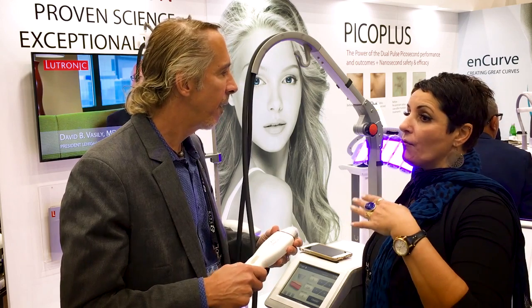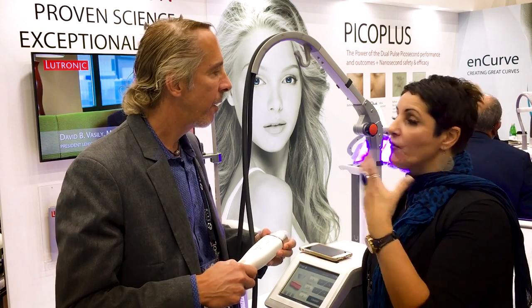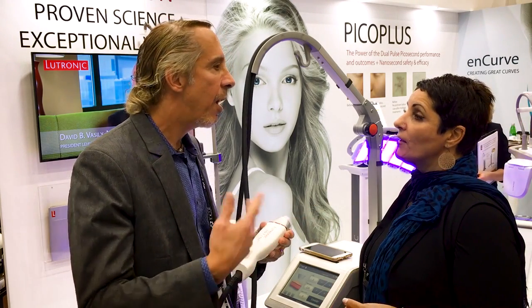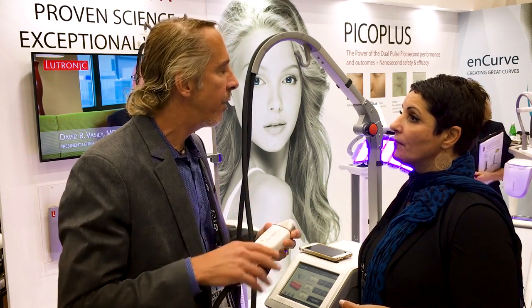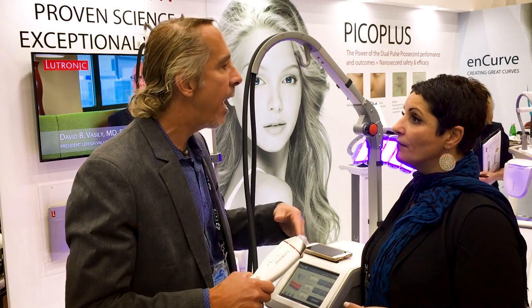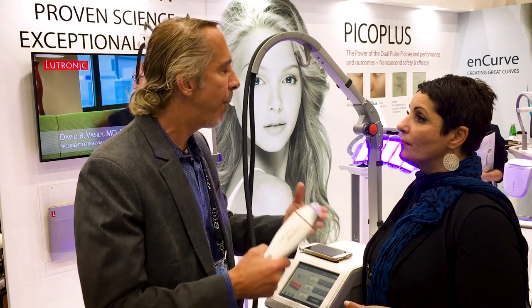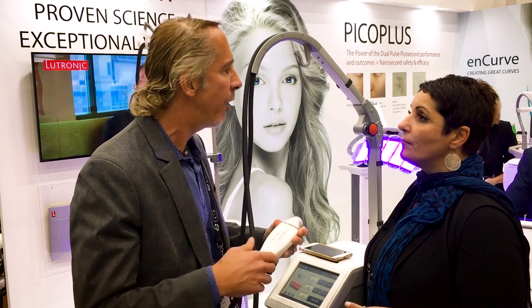So 3 treatments, 1 month apart, and then probably every year just go and have one more treatment to maintain that level of skin beautification that you've got from it. Right. I forgot to address a question you had earlier. This causes coagulation, which is a heat beneath the skin, and that causes the body to repair that area. So it rejuvenates the area because it brings in all these new reparative tools. That's why the skin looks brighter as well, because it has all this new collagen laid down.